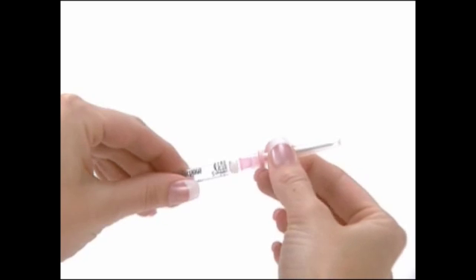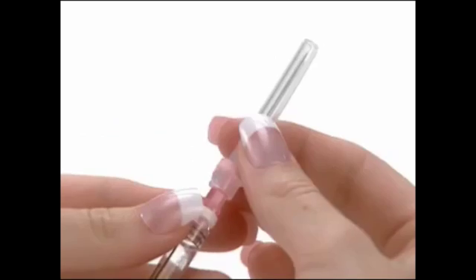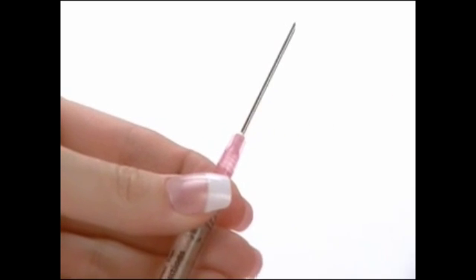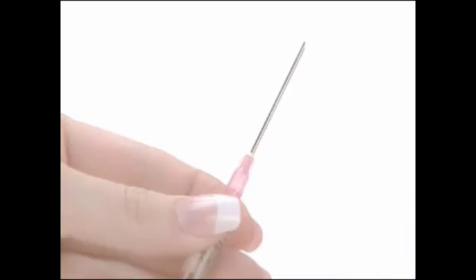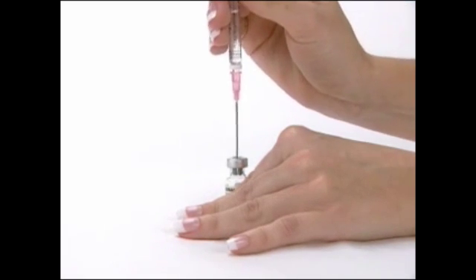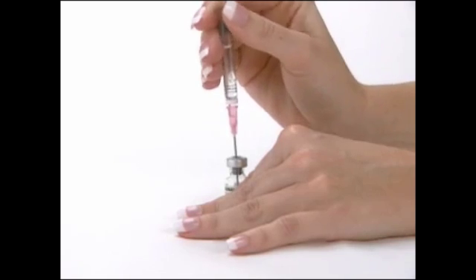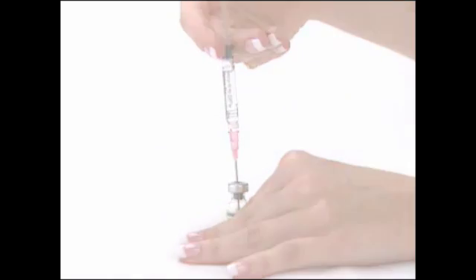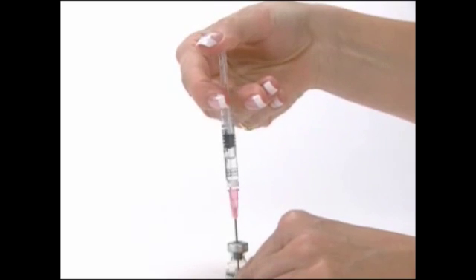Holding the hub or base of the needle, secure the needle on the tip of the pre-filled syringe and remove the protective needle cap. With the vial of Gonal F RFF powder on a flat surface, insert the needle of the pre-filled syringe straight down through the marked center circle of the rubber stopper. Slowly inject the water into the vial by pushing down on the plunger.